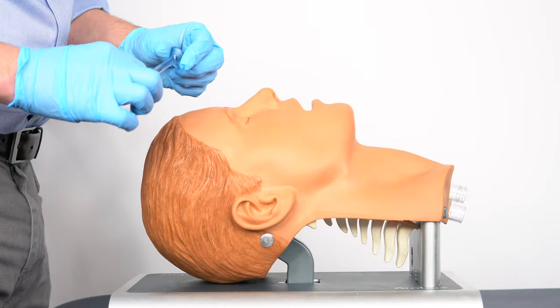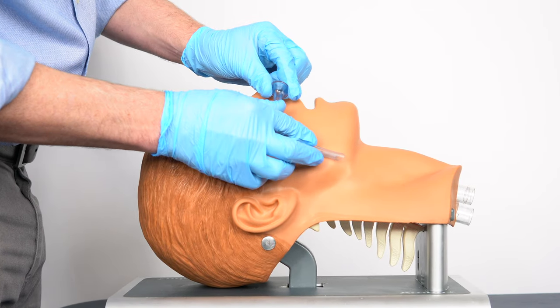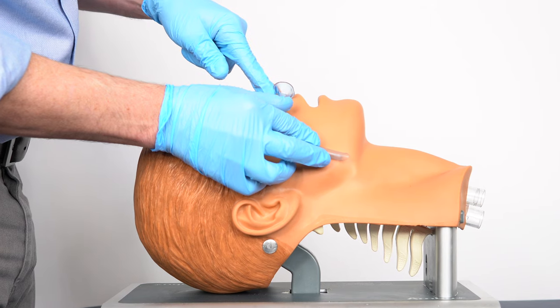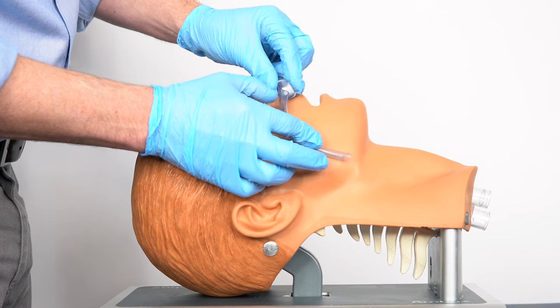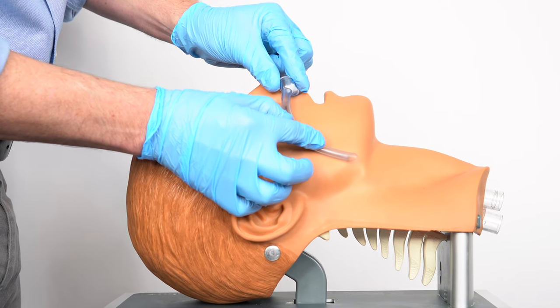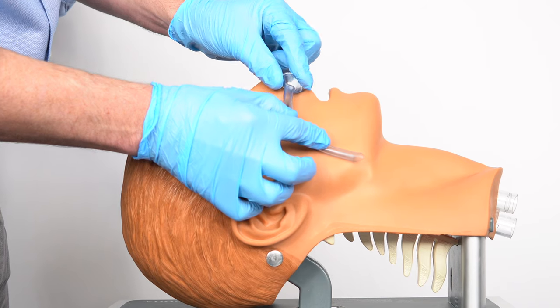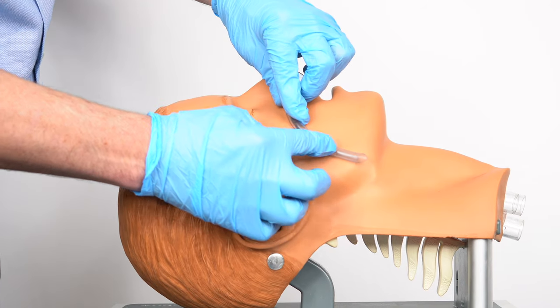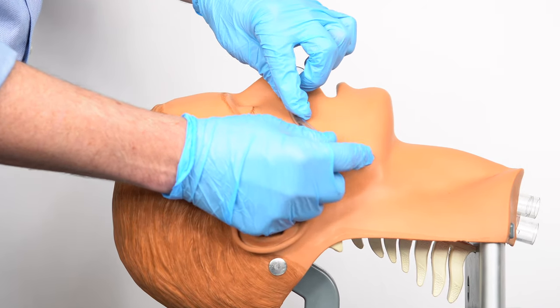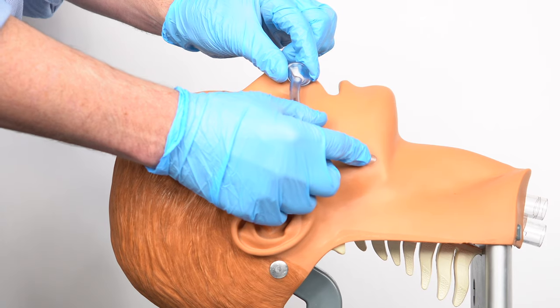Once the nasopharyngeal airway is in position, it's going to sit roughly like this — with the flange at the nostril, the first part of the tube going along the floor of the nasal cavity, and then gently curving around so the tip is sitting in the back of the oropharynx.